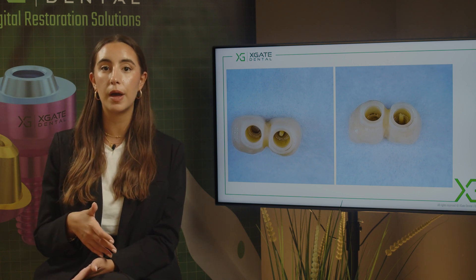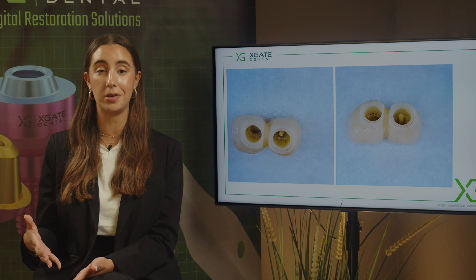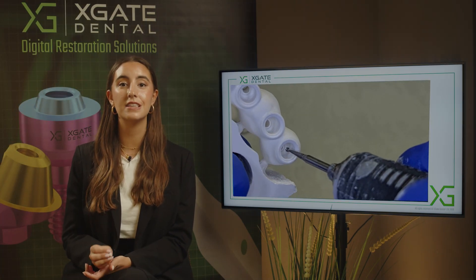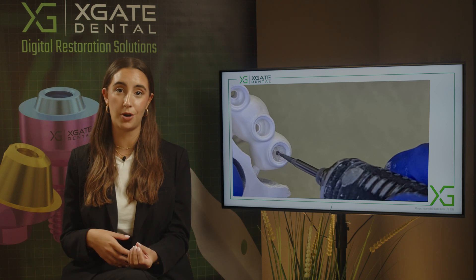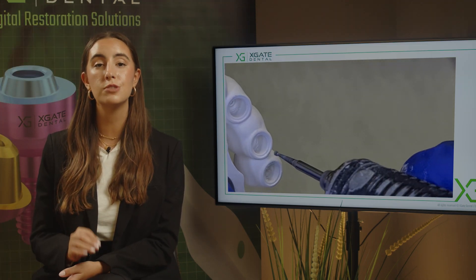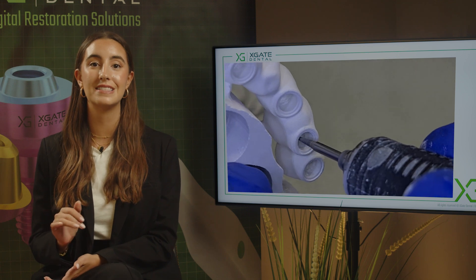You need to break the cement to remove them — they're not so easily removable. We made a small video showing how we make them. You can see here that this is the zirconia before the sintering process, and we are taking a very small burr and making very small undercuts in the parts that are inside the crown.